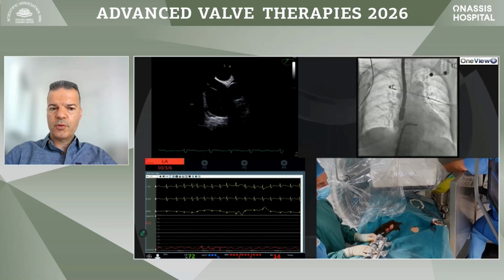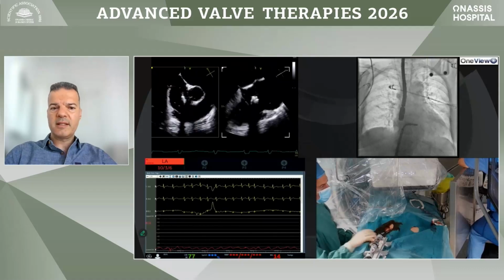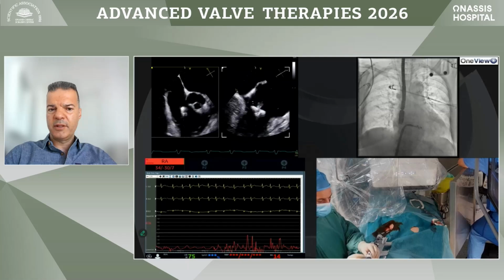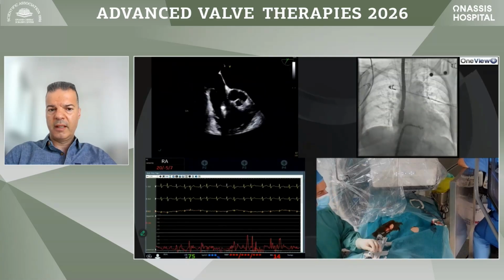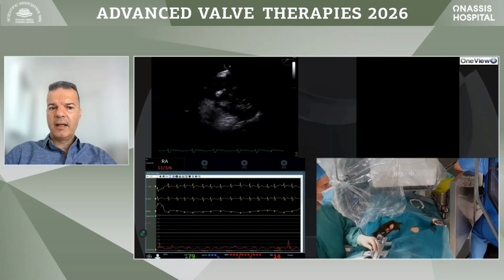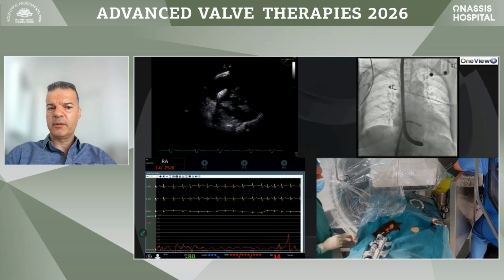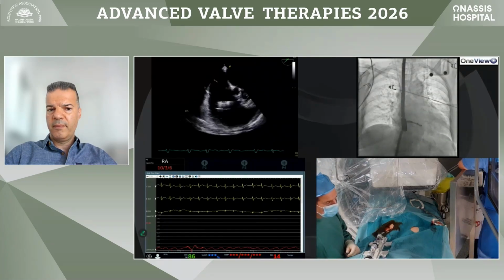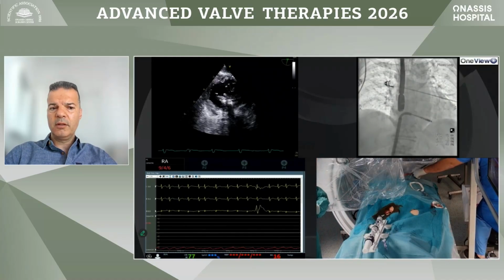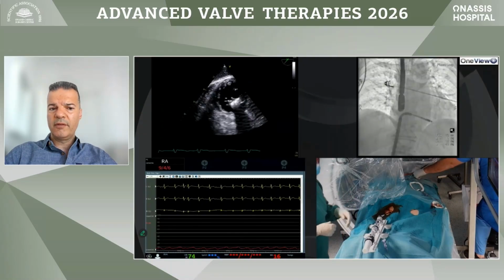And then once we find our position above the tricuspid annulus, we switch to the right ventricular inflow-outflow view. On the left, you can see we go to the anteroseptal region. We try to get perpendicular access to both axes, and once we open the arms, we go to the transgastric views. We really push a little bit more anterior. We want to be in the anteroseptal region, and we try to have our clocking perpendicular to the coaptation line. In this particular patient, we decided to grasp both leaflets on the transgastric view. We do that quite frequently these days.